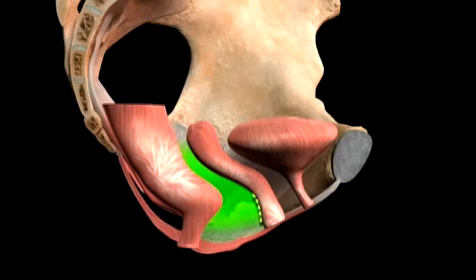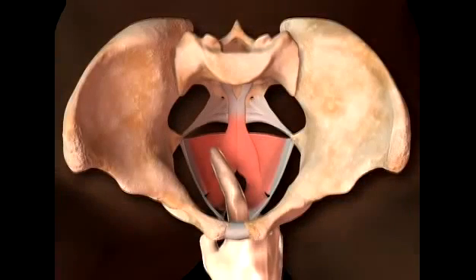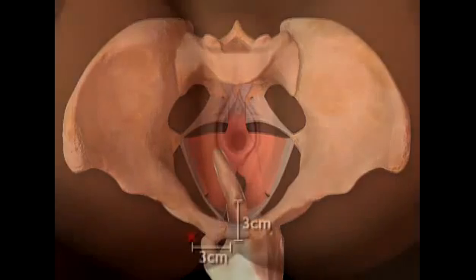the levator ani muscles. The rectovaginal space is easily developed surgically by incising the lower half of the posterior vaginal epithelium, full thickness, and opening the space with the finger. The finger dissection extends pararectally back to the ischial spines and sacrospinous ligaments.